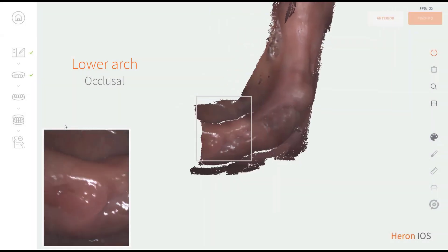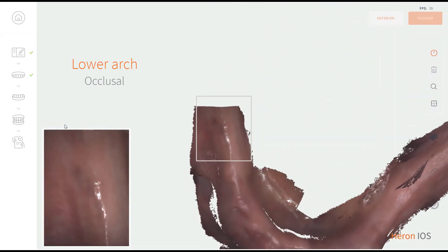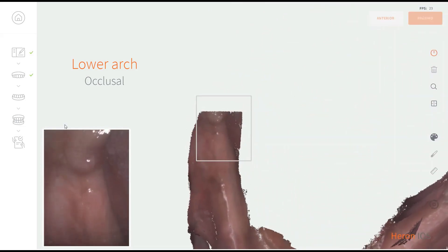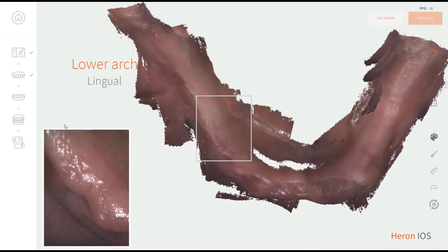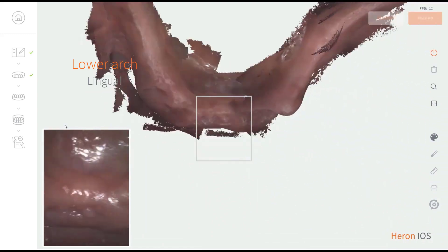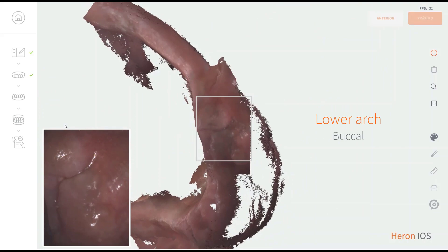The lower arch is usually more challenging due to the tongue and excessive moving tissue, so controlling these factors is key. The lower arch follows the same protocol, but instead of buccal, scan lingual secondly after the initial occlusal scan, holding the tongue with the back of the scanning tip.